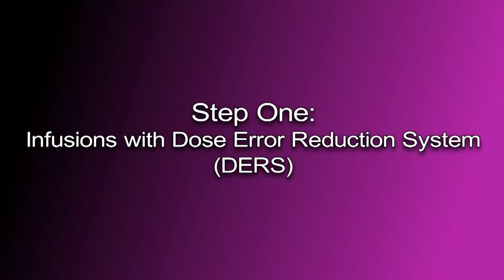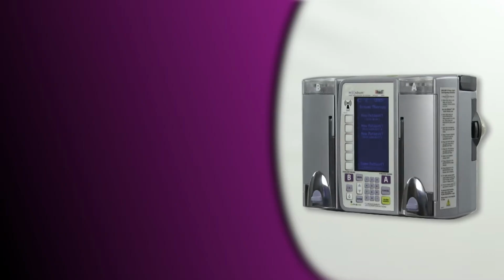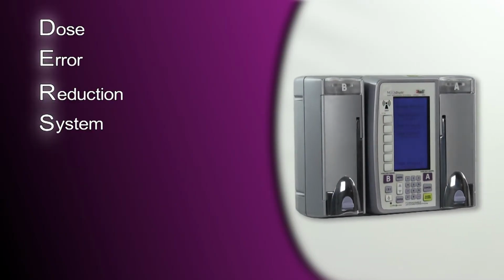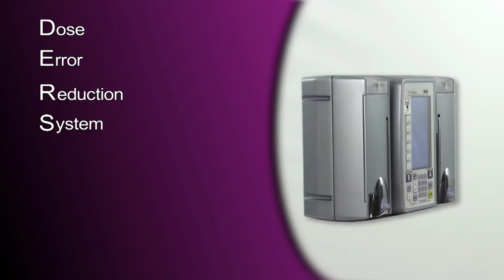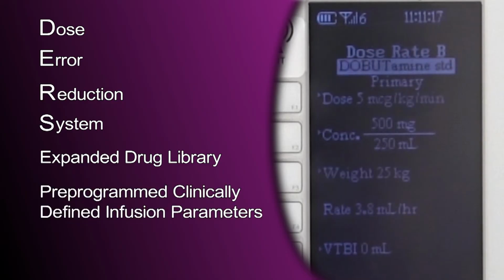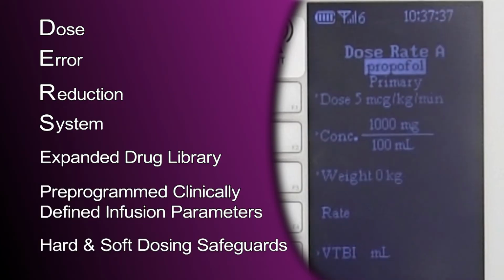Step 1. Infusing with the dose error reduction system, or DERS. IRadimed offers an optional feature for the 3860 pump called Dose Error Reduction System, or DERS. If your facility has purchased the DERS option, the pump will have an expanded drug library, complete with pre-programmed clinically defined infusion parameters, as well as hard and soft dosing safeguards.